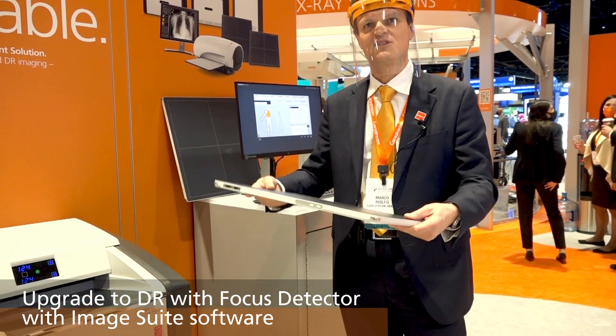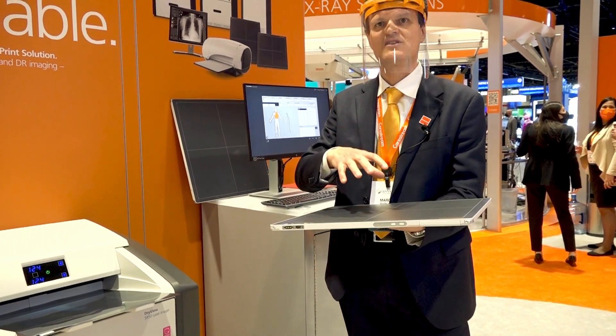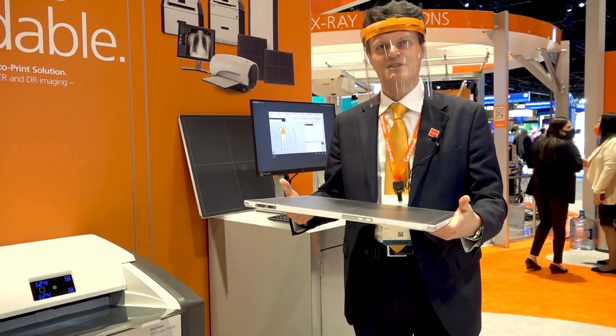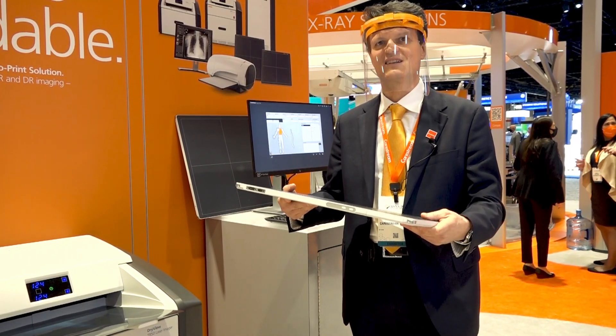The automatic exposure detection capability allows you to simply acquire the image in the same way you would with a film screen or CR cassette. Setup is quick and neat as no cables are routed around the X-ray device.